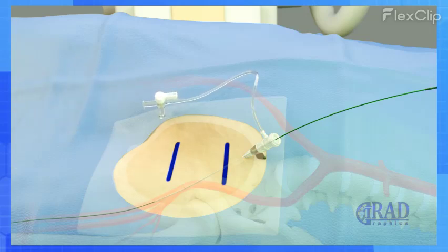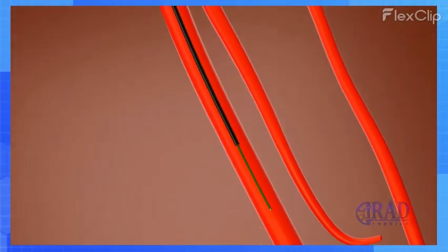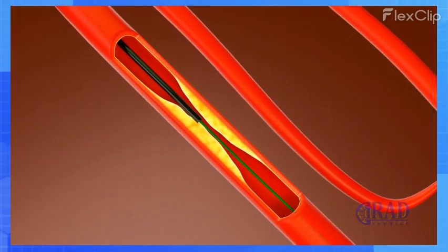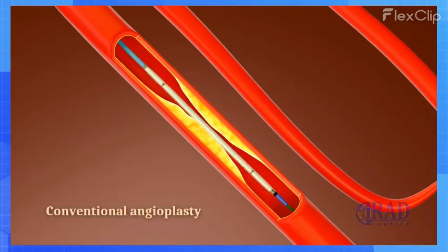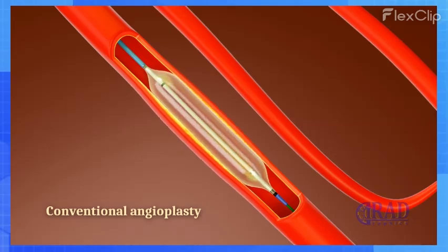An angled catheter is then advanced over the wire, through the sheath, and into the superficial femoral artery to cross the narrowed area and pass beyond the atherosclerotic lesion. The catheter is removed, and an angiogram is performed to assess the nature of the narrowing and determine the appropriate intervention. Four common interventions are considered based on the findings.